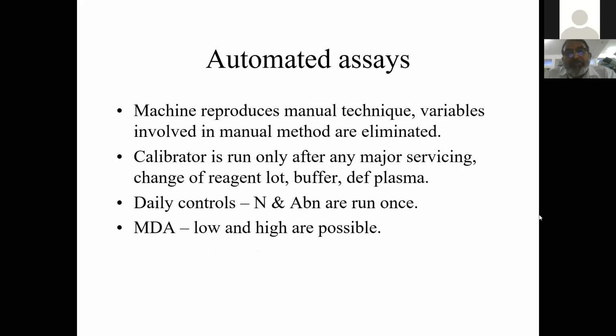Now, many of these assays can be automated into machines to reproduce the manual technique, which I think all of you did. Variables involved in the manual method are eliminated. But probably Dr. Bipin and Dr. Rucha may have made you do the PT and APTT manually, but for the factor assays, they have used the semi-automated machine, which I have seen them use in the workshop that they conducted in Bhopal.